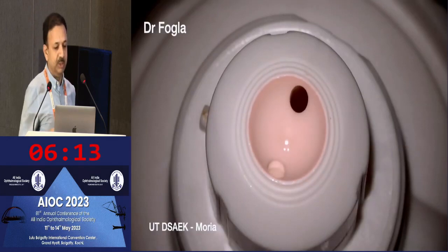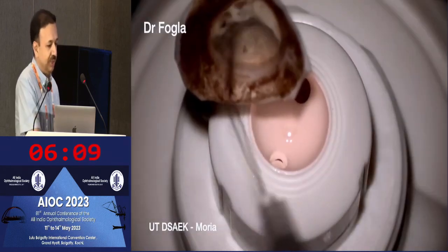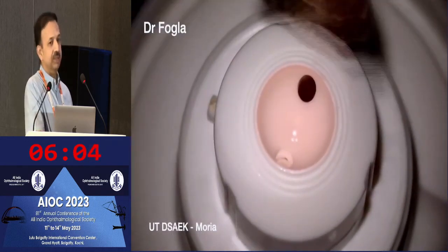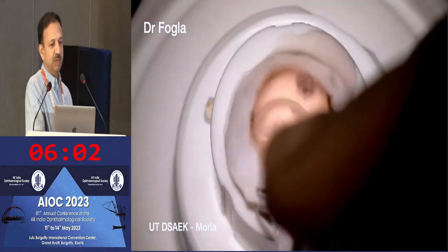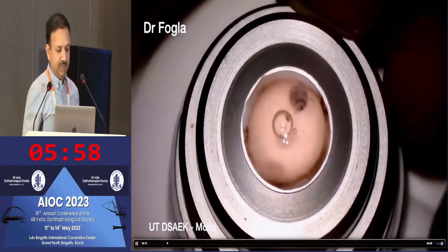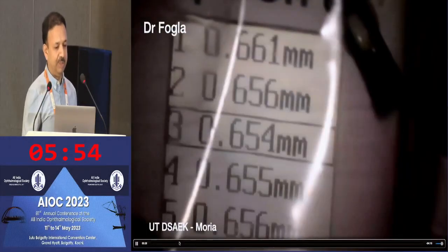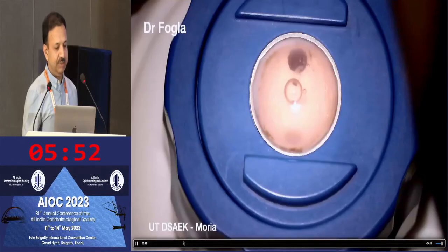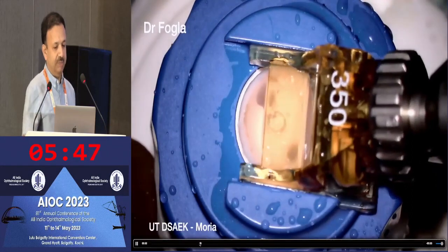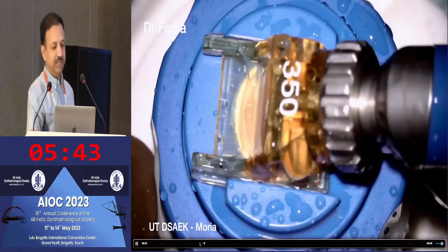So how do you prepare the donor? The double-pass technique. We use the corneoscleral rim provided by the eye bank and protect the endothelium using viscoelastic. Then we mount it on the artificial chamber, debride the epithelium, and perform pachymetry. You can see it's about 654 microns because it's stored in MK medium — tissues are a little swollen. We then use a 350-micron head to make the initial pass to create the free cap.